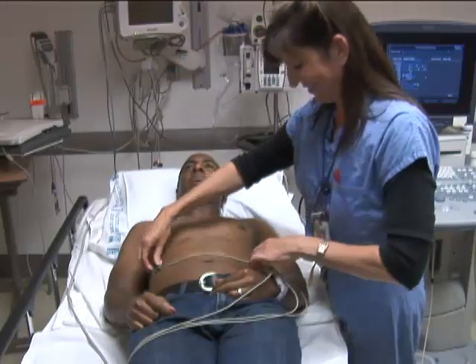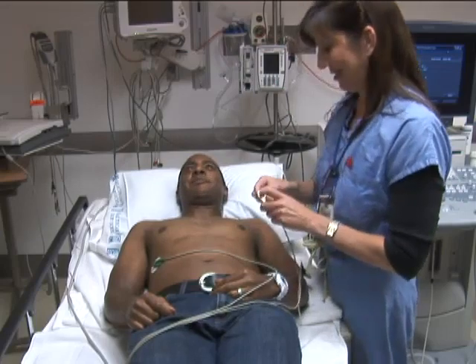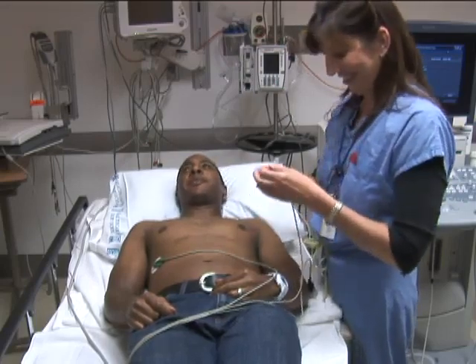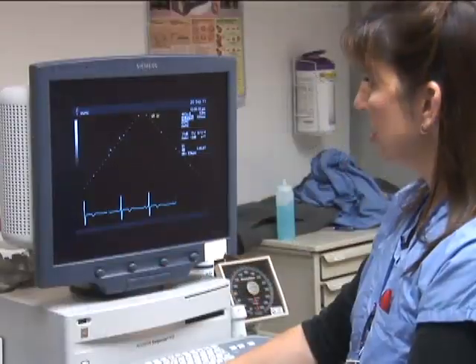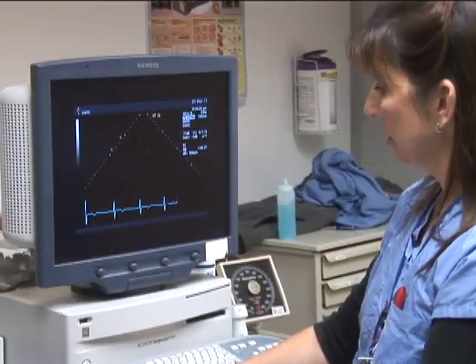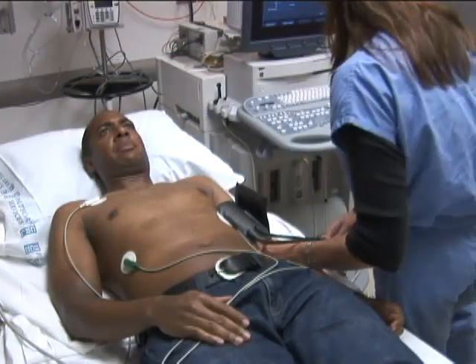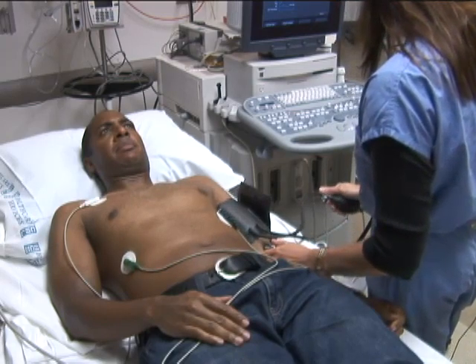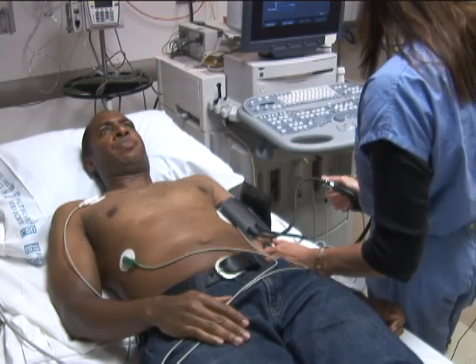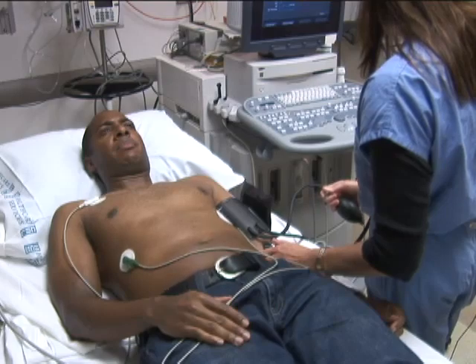The ECG leads are placed on the left and right shoulders, and the patient's left side, a lead 2 orientation, and the ECG signal is adjusted to ensure the QRS is well defined and higher than the T wave. A suboptimal ECG signal may lead to incorrect triggering of cine loop image acquisition. Height, weight, blood pressure, and heart rate are recorded before starting the exam.